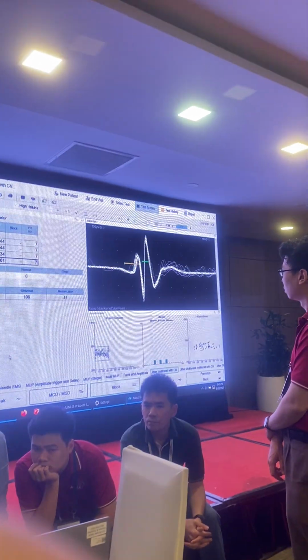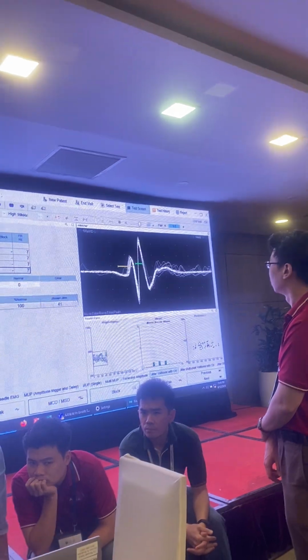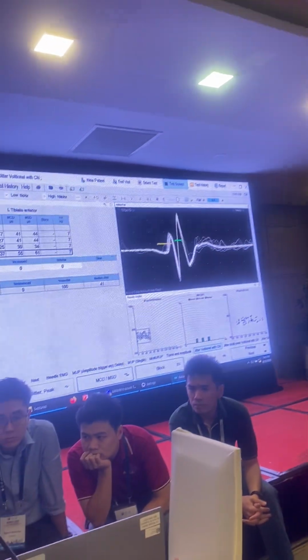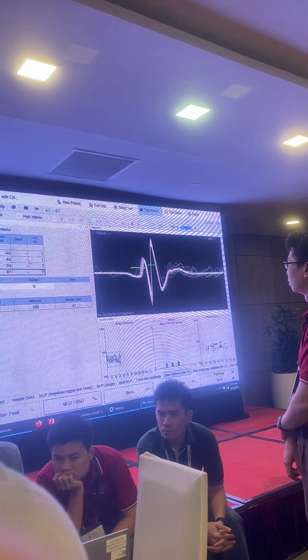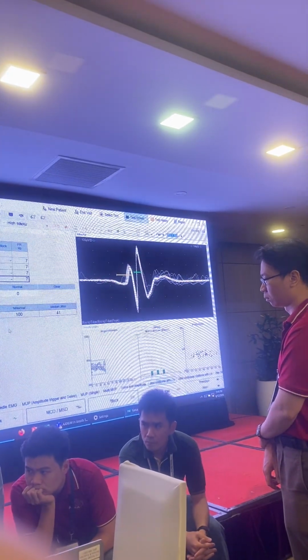And let's say, what have I done? So I have recorded 3 pairs. Jitter was 41, 30, 55. These are all normal. My median jitter was 41. There is no blocking. So that's the way it's going to be a normal study here.